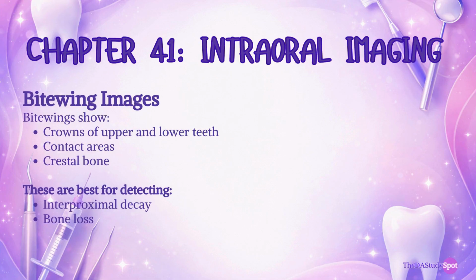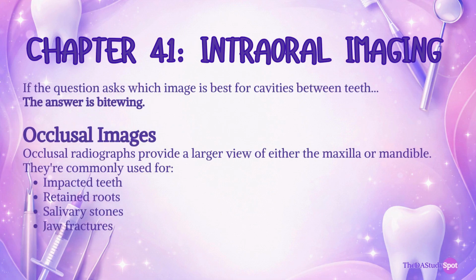Then we have Bitewing images. Bitewings show crown of upper and lower teeth, contact areas, and crestal bone. These are best for detecting interproximal decay and bone loss. If the question asks which image is best for cavities between teeth, the answer is Bitewing.